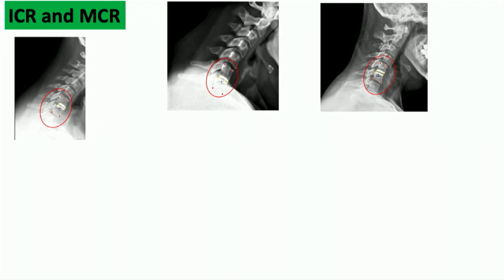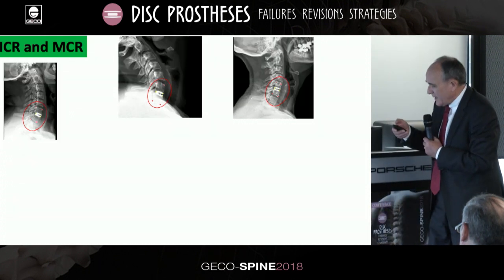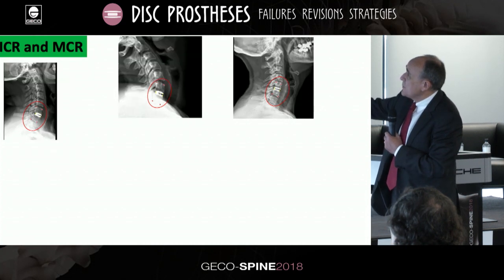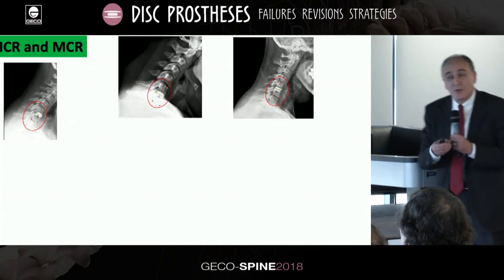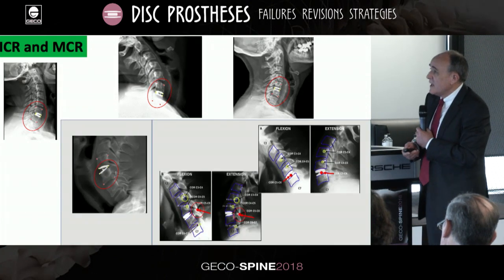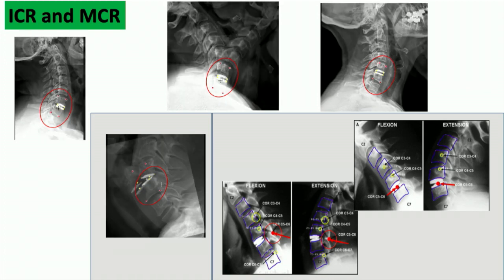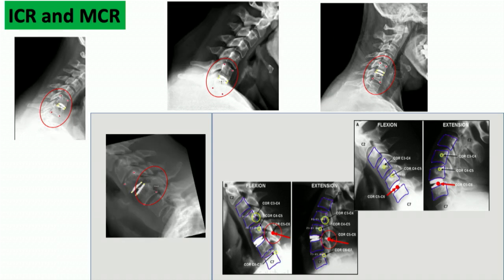But when we look at our everyday life patient, I don't know if you see this very well, but now we have very interesting tools showing we are able to reconstruct very easily the center of rotation of those patients when doing relocation of the images. And it is very interesting to see that in some cases, I choose a case with a very atypical center of rotation. You see this patient has a very posterior center of rotation.